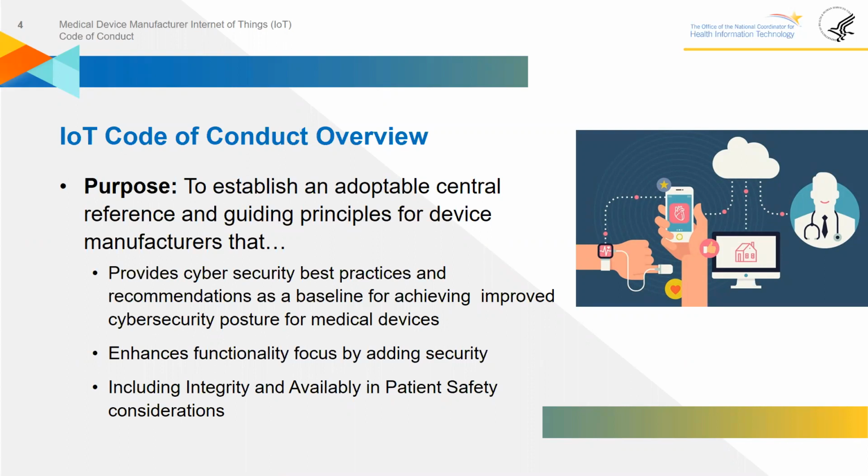We also know that the security objectives of medical devices are concentrated around patient safety and focus more on integrity and availability. However, most cybersecurity professionals acknowledge that cybersecurity risks can also affect patient safety, and the threats and vulnerabilities for cybersecurity risks can be much broader in scope than typically safety hazard harm or device failure, meaning that there are other technical vulnerabilities that go along with cybersecurity risks that could impact patient safety if a medical device was compromised by those vulnerabilities.